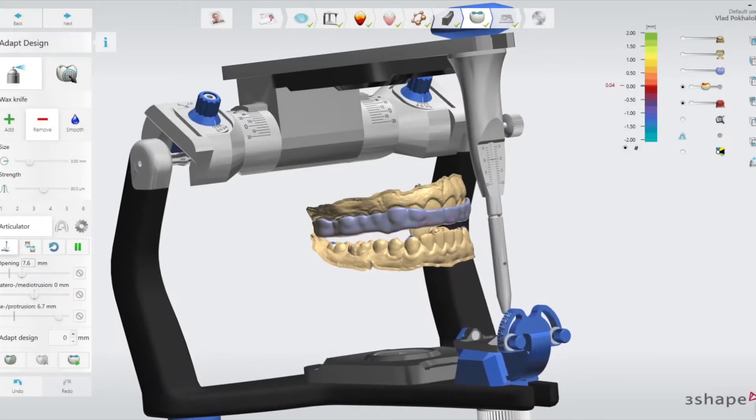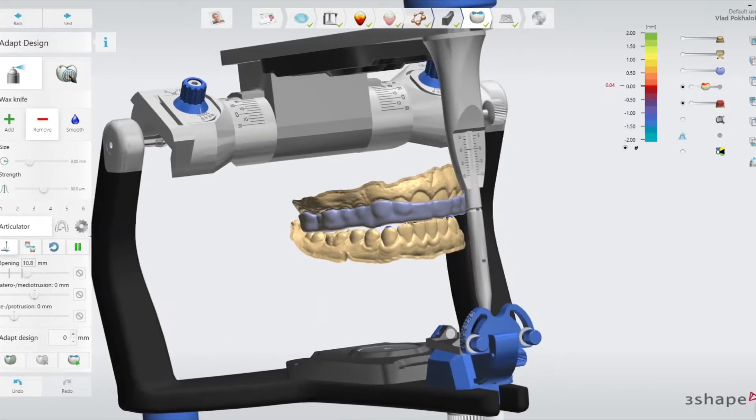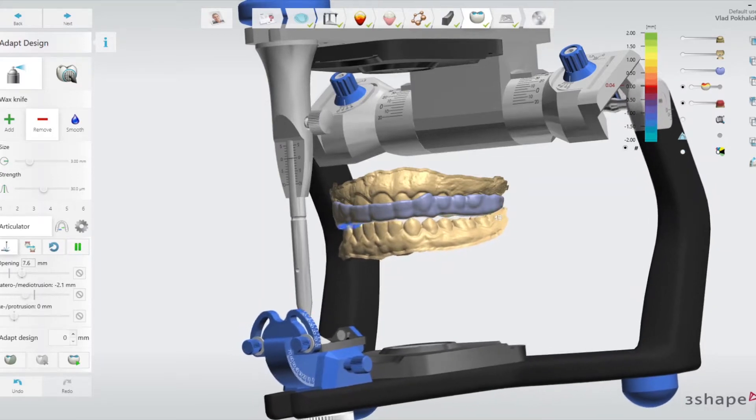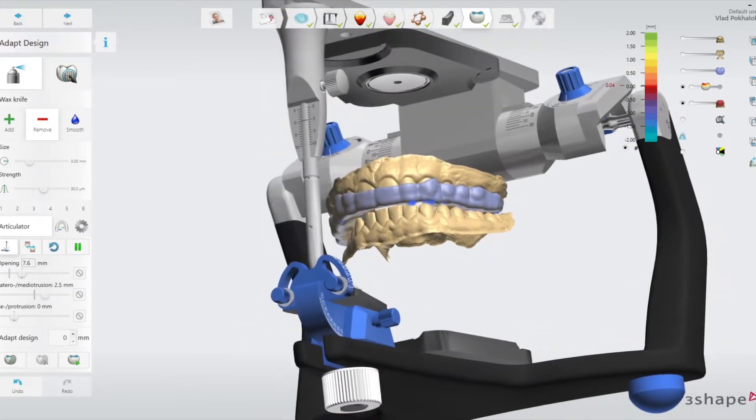The 3D printed night guard is designed digitally with advanced orthodontic software. This digital technology provides a technician with tools to design a high-quality appliance with a precise fit.